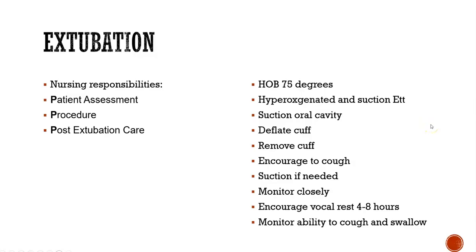All right, so extubation. Our nursing responsibilities for extubation are going to include a patient assessment, helping with the procedure, and then post-extubation care. So we want to make sure that the head of the bed is 75 degrees. We've hyperoxygenated and suctioned them prior. We've suctioned their oral cavity.